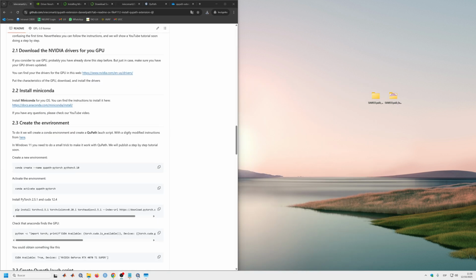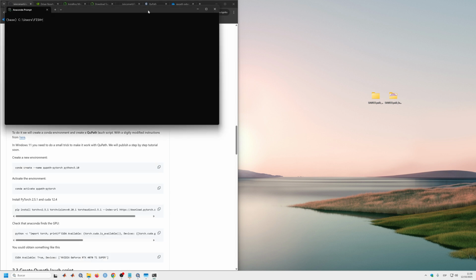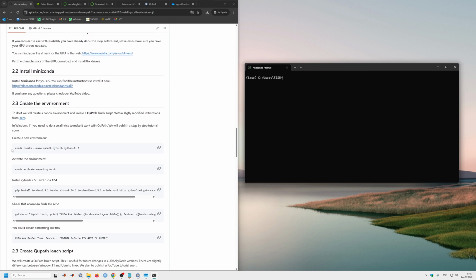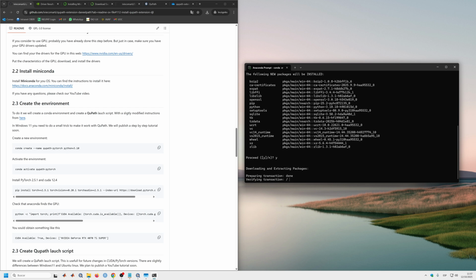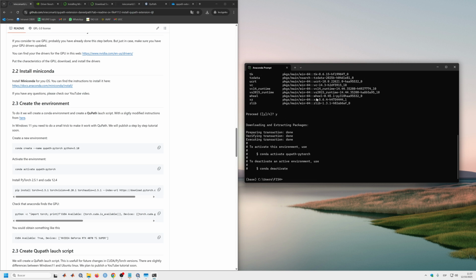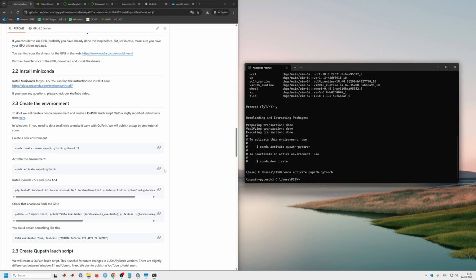Okay, so now if we go over here, we have the Anaconda prompt. We can open it. Okay, so the next step is to create an environment. So we need to copy this line over here. We paste here and say yes. Now we need to activate the environment. The environment is activated, okay?